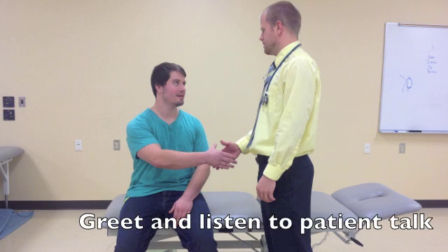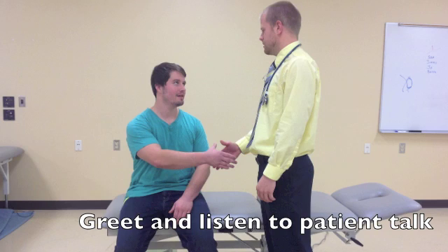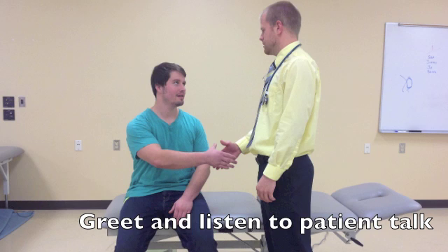Before auscultation, during your introduction to the patient, listen to the patient talk, noting labored speaking, shortness of breath, abnormal pitch, or pain.